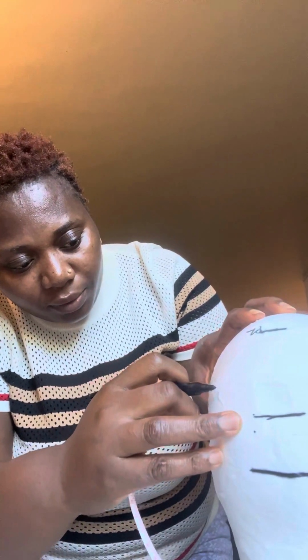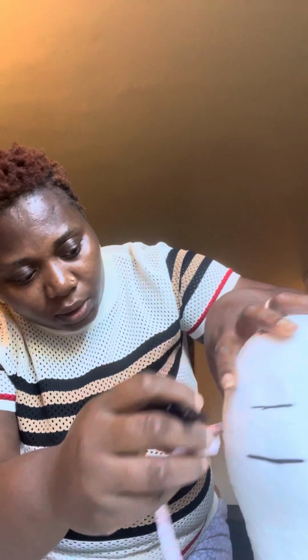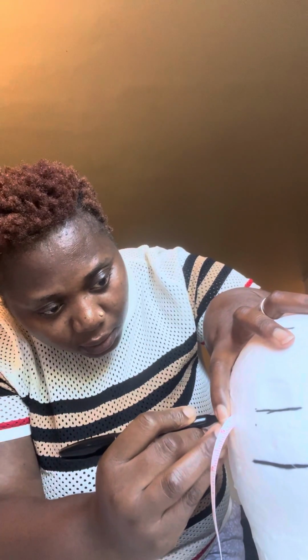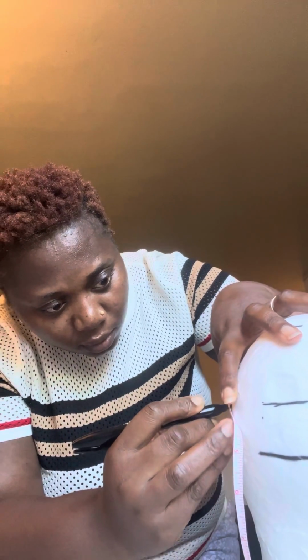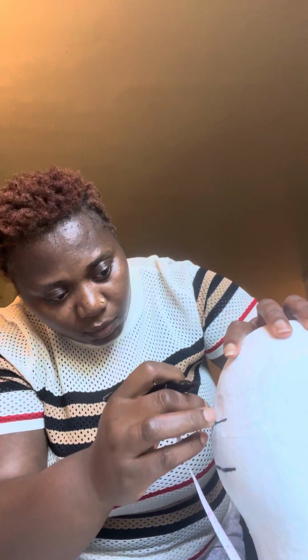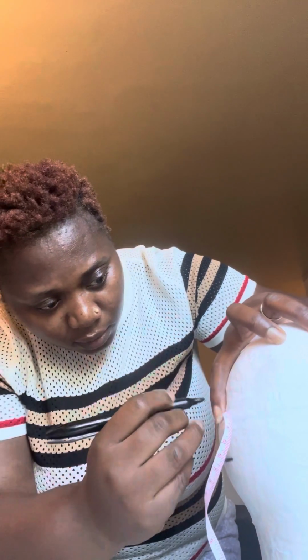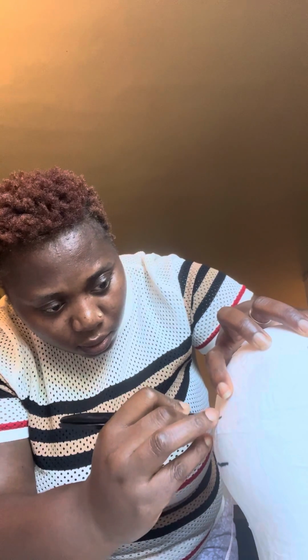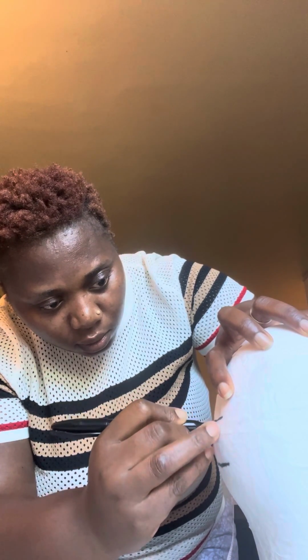From your T3 to T5, 5.3. T5. From your T5, 5.3 to your O1. Your O1. I will do the same thing on this side.